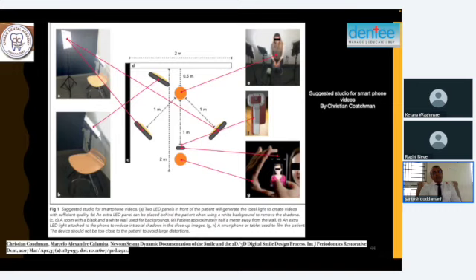So Christian Coachman has given this outline for those who are interested to have a dental studio setup. You can see the horizontal line here on top, that is 2 meters, that is a wall. One wall is white in color and the other wall is black in color, right? So whatever contrast you want, you can use the wall.